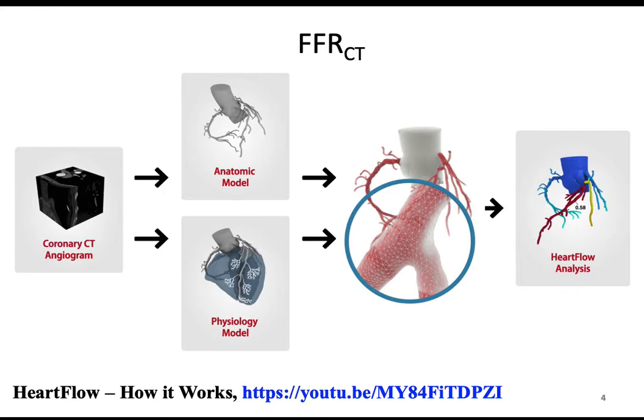And so the idea is to eliminate the burden of having to cath people, making the measurement and saying, okay, this is normal. Right? And you got all the way there to catheterizing somebody, doing this really expensive procedure, and you didn't do any stenting or any intervention. And so the idea is that this could clear people that have what looks like a stenosis but isn't actually functionally significant. Put another way, it would give the cardiologist more confidence that when the radiologist tells them there's a lesion there, it's something that they would intervene on, or that it would be functionally significant.